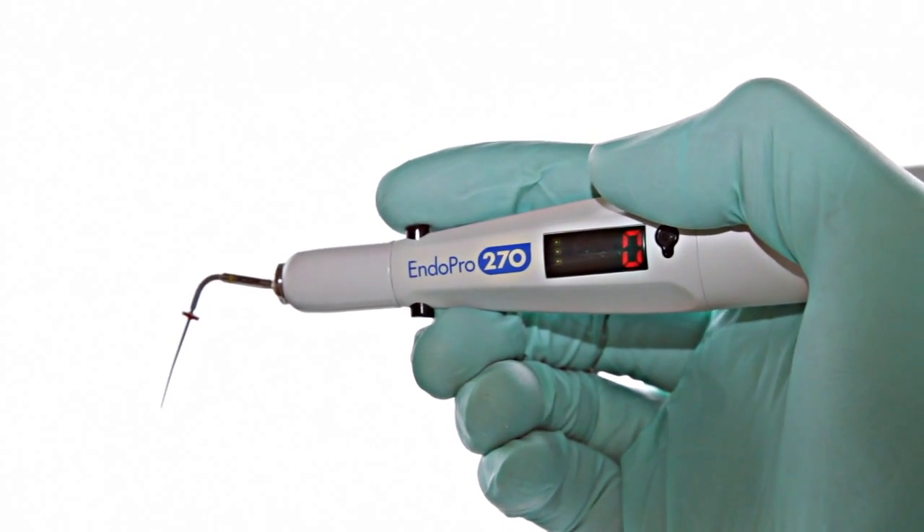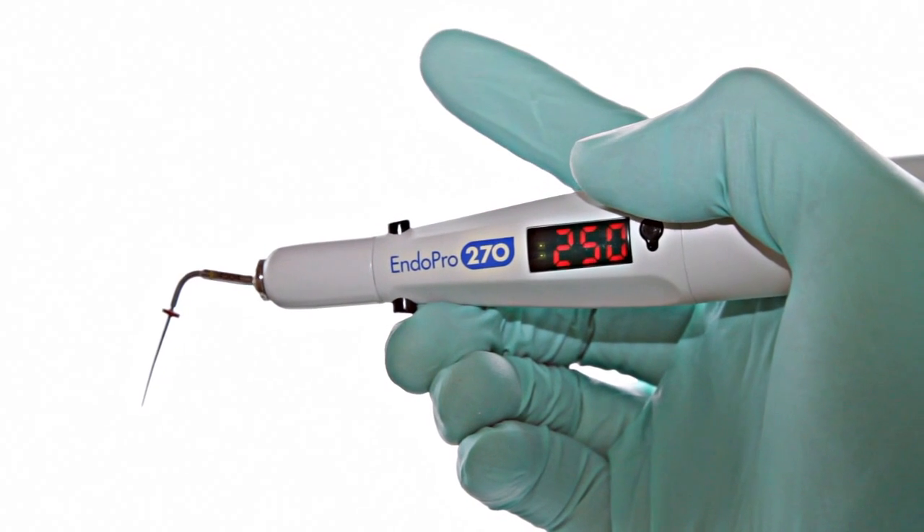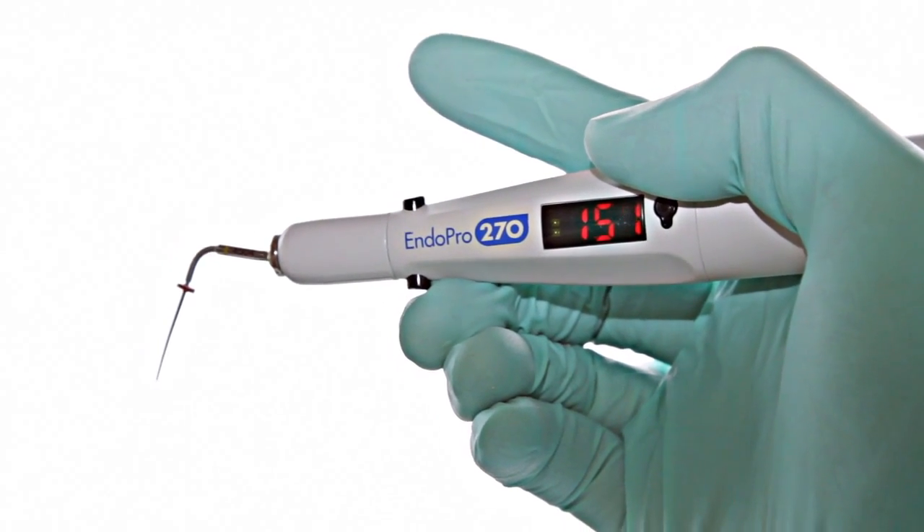The unit is activated by pressing a button that reaches 270 degrees very quickly, and upon release the temperature returns to normal rapidly.